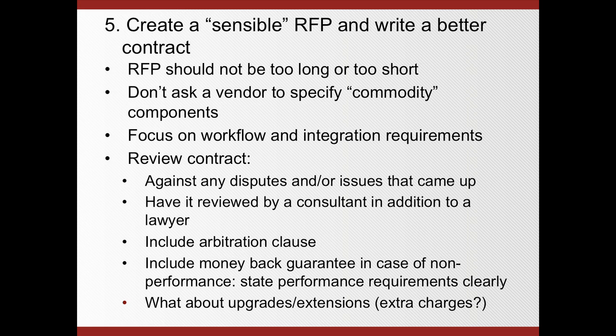Not necessarily somebody who is versed in legal terminology like a lawyer, but somebody who is really knowledgeable about the PACS and RIS systems in detail. And of course, you might want to include an arbitration clause that says if the system is not accepted within 6 months after so-and-so date, then you might want to have the money back, or you might want to go to arbitration, in front of an arbitration judge, and find out what really happened and who is right. So you would resolve some of the yes-no situations. And again, worst case, you might want to include a money back guarantee in case the vendor cannot perform.